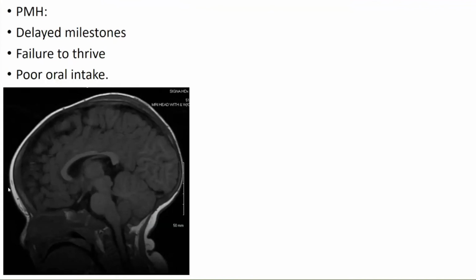Maybe Paul is not there. Let's go to Niall. Looking at this MRI, the structures all look very abnormal to me. And looking here, there's some kinking at the medulla, and everything looks sort of superiorly displaced. So I don't know if there's some basilar invagination going on here. It looks abnormal. It's hard for me to put a finger on exactly what it is.